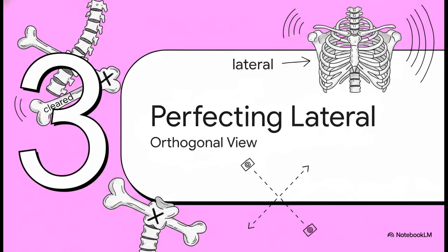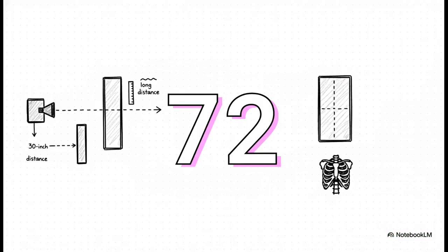Section 3. Perfecting the lateral sternum. Okay, so we've cleared the spine from the front. Now let's look at it from the side. Ready for some whiplash?